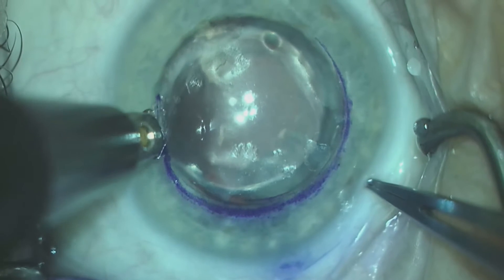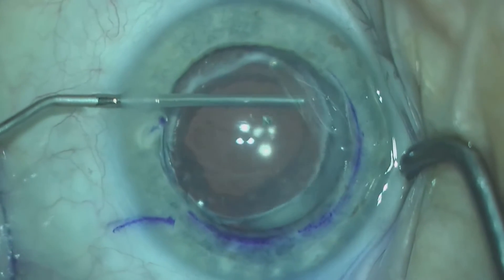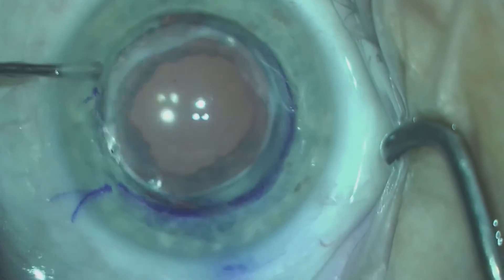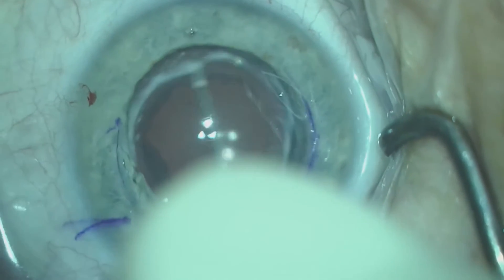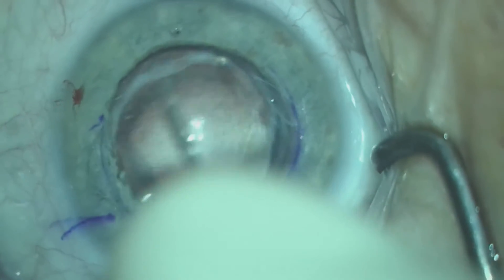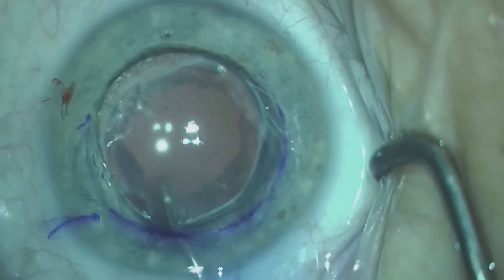This is also a post-vitrectomized eye and an open bag. We start the procedure by making an LRI to alleviate some of the residual astigmatism that the patient had. The anterior portion of the eye is filled with viscoelastic.